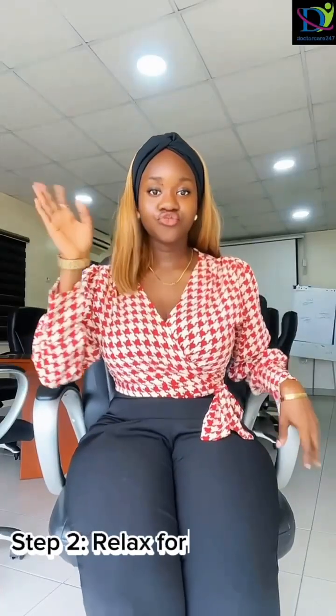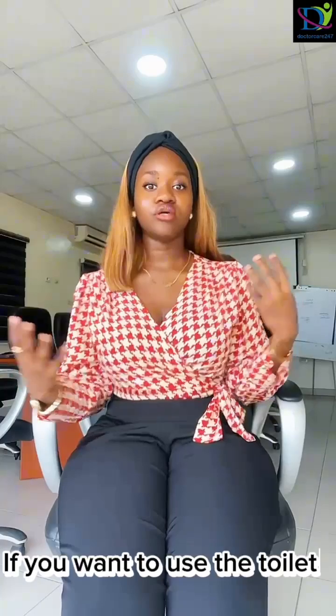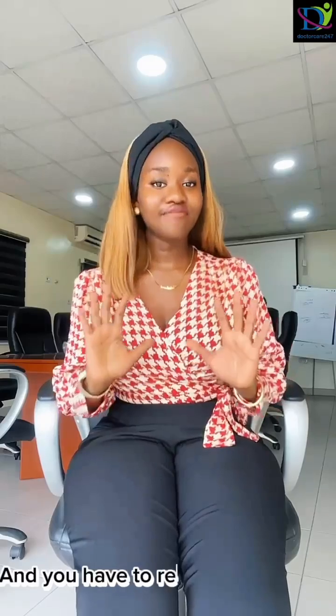Tip number two is to relax for 5 minutes before you check your blood pressure. And how we do that is, number one, if you want to go to the toilet to ease yourself, please do that before you check your blood pressure, and you have to relax for 5 minutes before the whole process starts.